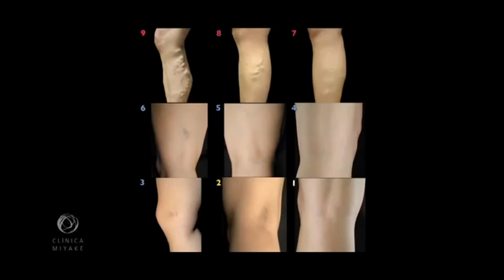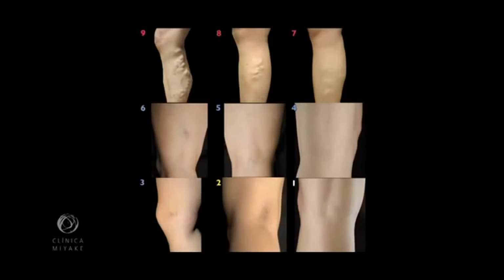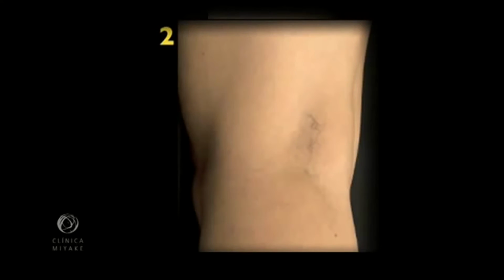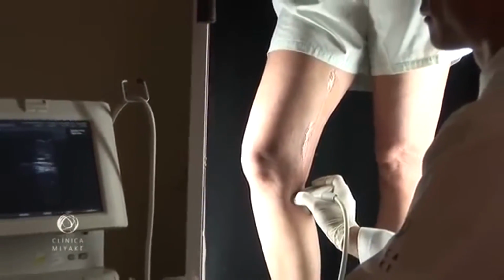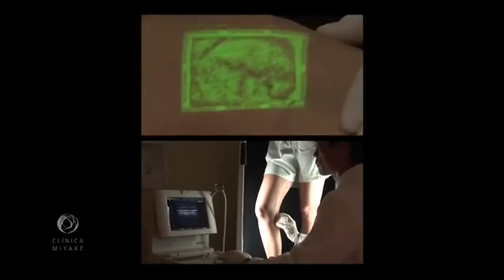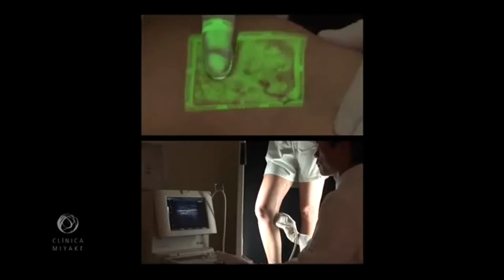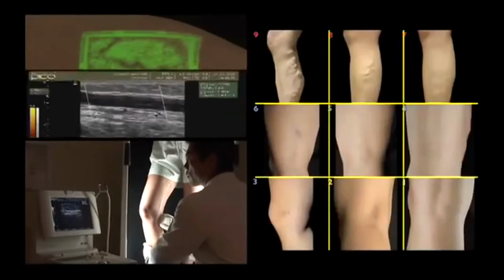This classification helps us to select the treatment plan at a glance. Scores 9 to 7 generally need a more invasive initiative. Note that patients scoring 2 generally give the best results for any kind of sclerotherapy for the absence of feeder veins and varicosities. Ultrasound is the tool to pinpoint reflux on the saphenous vein. This, associated to the VeinViewer imaging, led us to group lesions that demanded different treatment modalities.